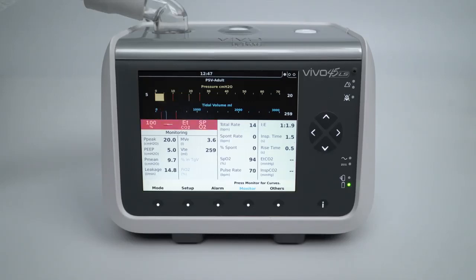In the status window, indication of battery status and connected sensors are displayed. The first icon shows the charge condition of the internal battery, followed by the external battery status. If no battery is attached, this will be blank. The battery icons will alternate between a green, yellow, or red color display, as well as a percentage of charge or time remaining on the battery.